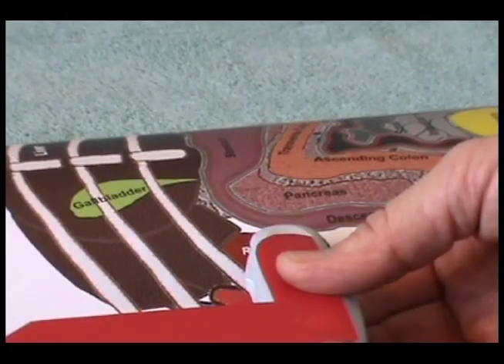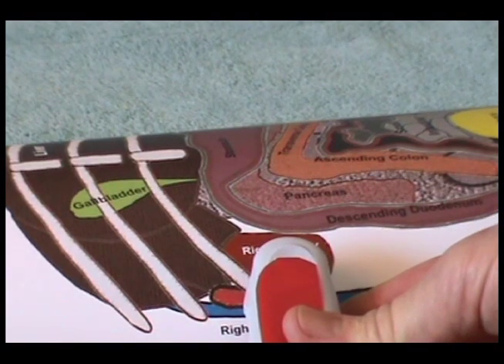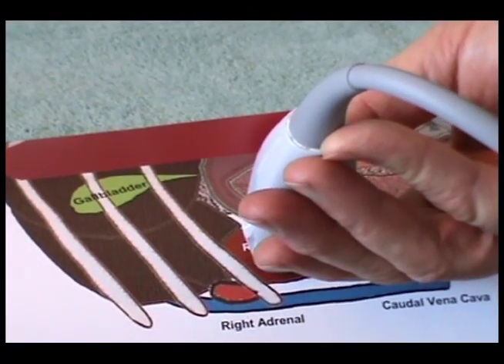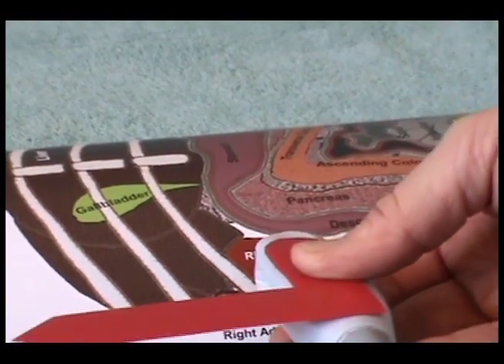When you have bisected the right kidney, fan the transducer ventrally till the transducer no longer points to the kidney. Then reverse directions and fan dorsally till the transducer no longer points at the kidney. Return to a perpendicular position.